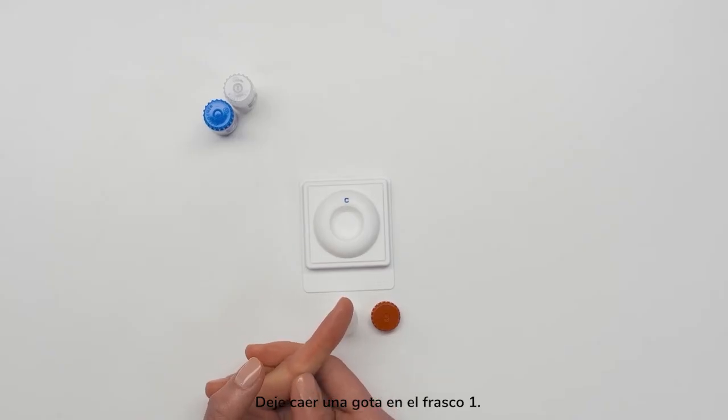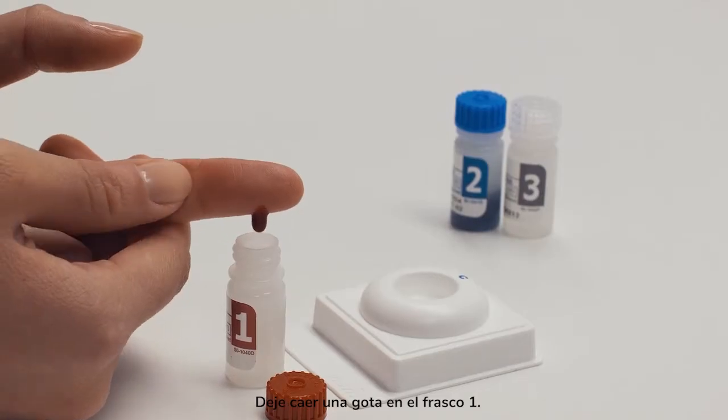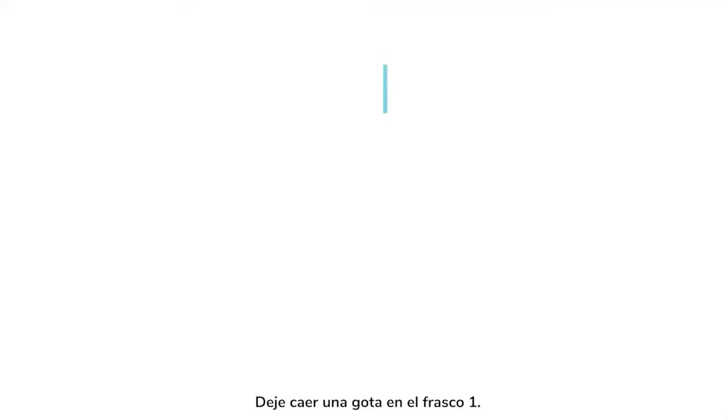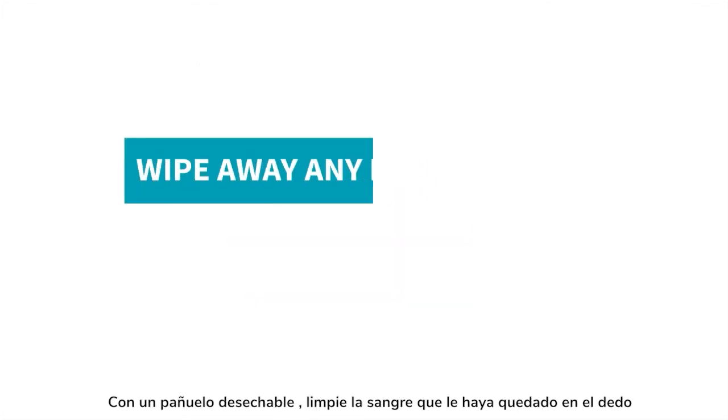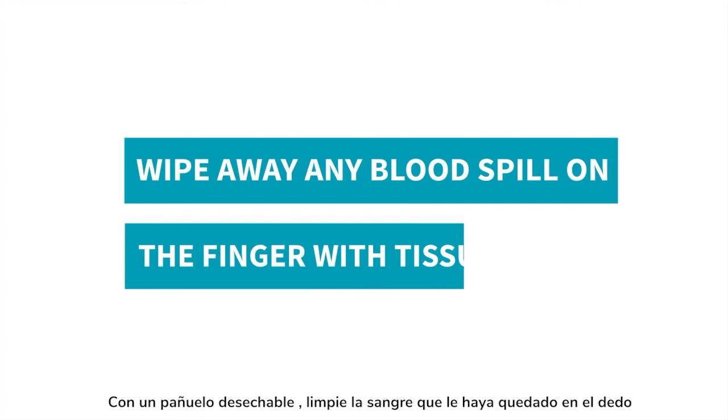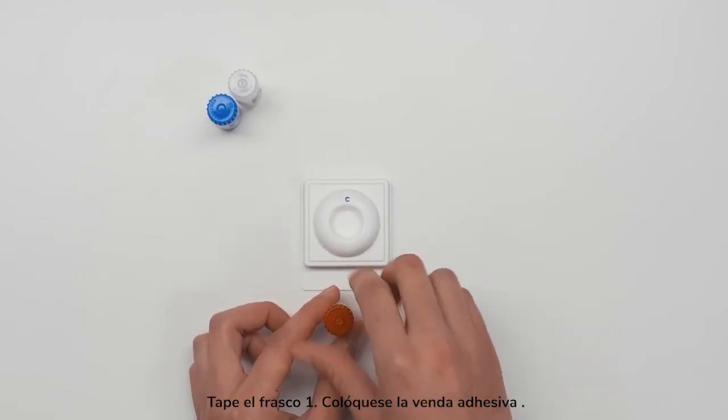Let one drop fall into Bottle 1. Do not scrape your finger on the bottle. Twist the cap back onto Bottle 1 and apply a bandage.